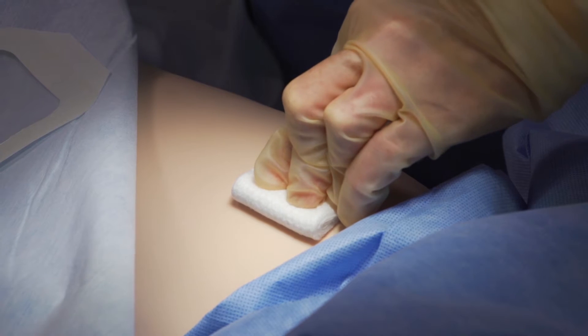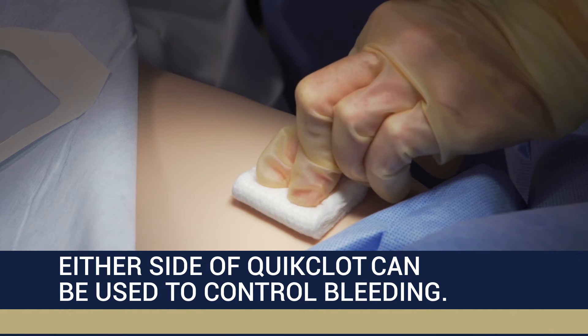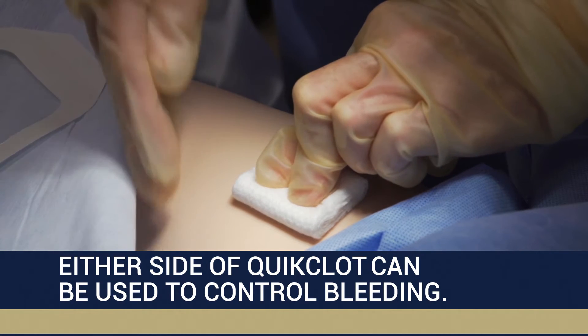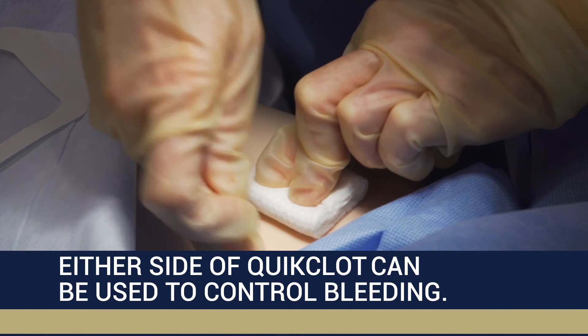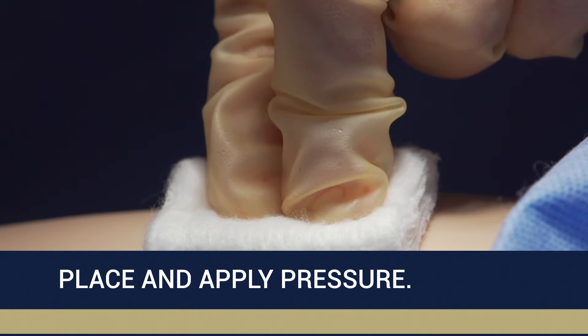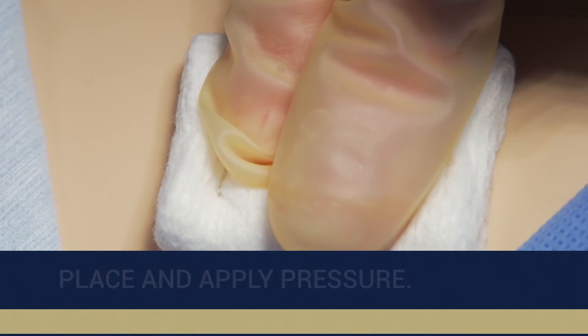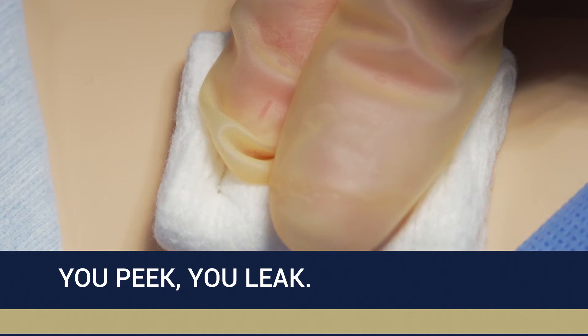Place QuickClot on the puncture site and apply manual compression on the pad for at least five minutes or until bleeding stops. Only a small amount of blood is needed to accelerate the clotting cascade when using QuickClot. Users should apply manual pressure over the QuickClot pad. Keep in mind that arterial punctures using large dilators will require longer manual compression time.